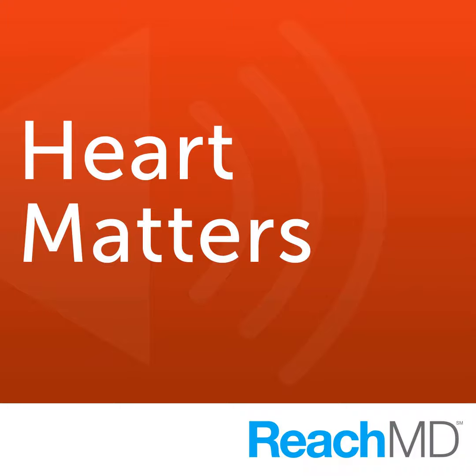And that's one of the things we need to monitor about CTA. If it proves to be completely normal, that's lovely, and we can feel very confident that it's pretty low risk for that patient. But if we do see something, that doesn't necessarily prove that's the cause of the patient's problem. We may need to do something further, but we all feel when we see that obstruction that maybe we need to fix it. Well, certainly those of you in primary care may not be as familiar with this as those in cardiology, but that is what Mark's describing, the oculostenotic reflex, unfortunately.